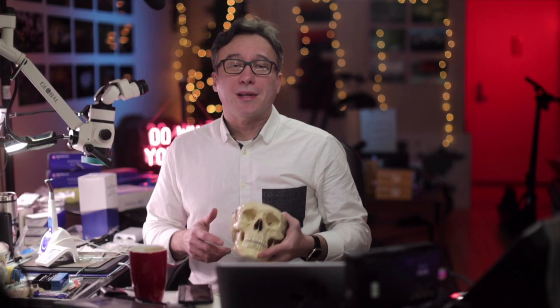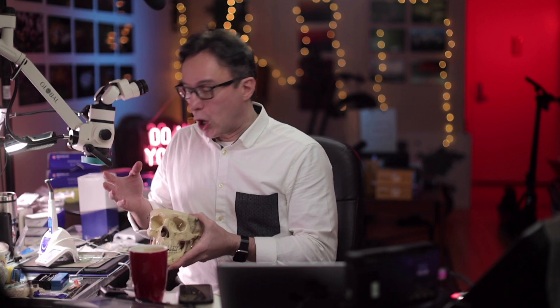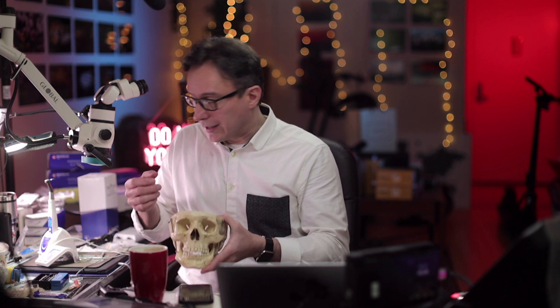Alright folks, I'm down here in my studio with my friend and colleague Ralph, who is going to help us demonstrate the concept of using Endosync and Endosync AI. Ralph volunteered for this. I'm just going to show the lip clip portion on Ralph, and the rest I'll do on a block because it will make a bit more sense.